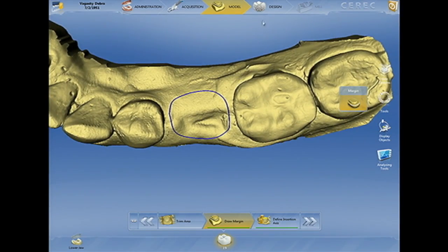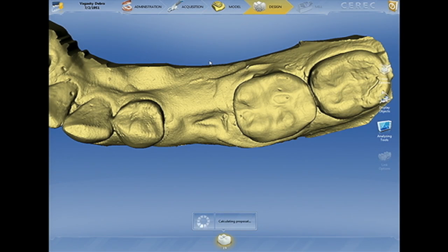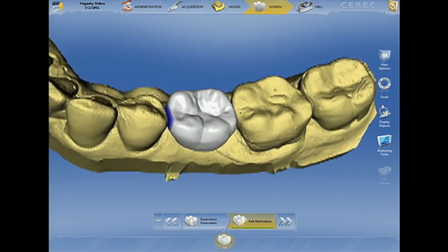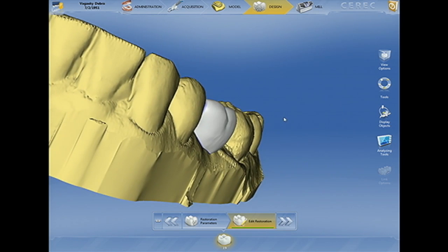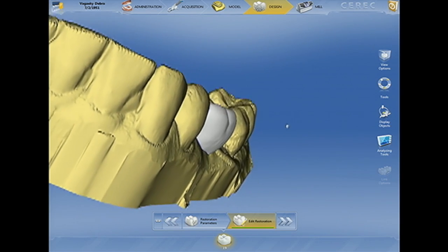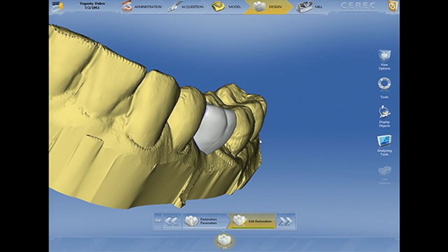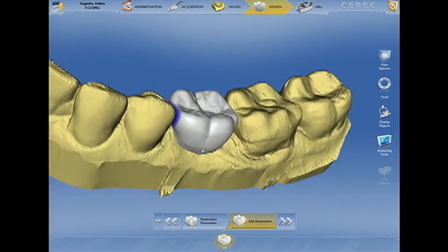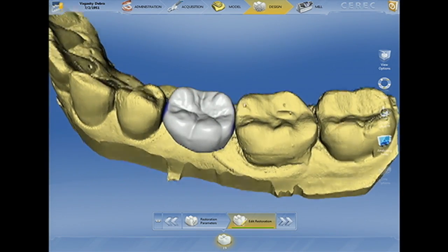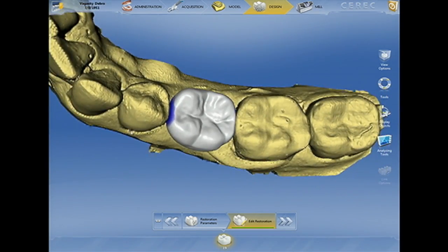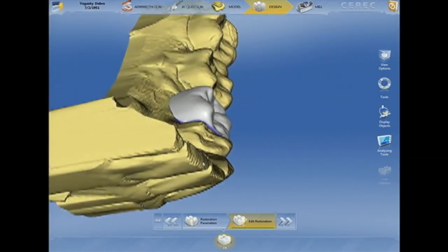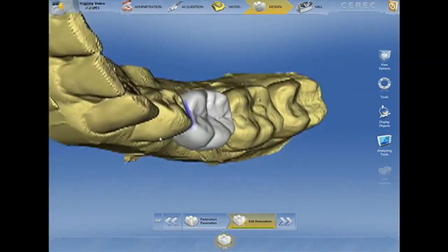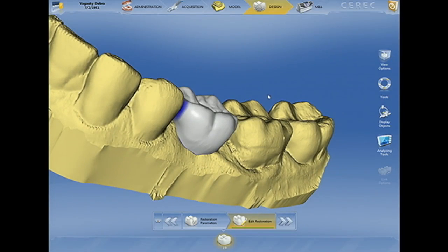Because I haven't necessarily taken the time to get the opposing, sometimes the software may not give us an exact proposal that's appropriate. But most of the time, it gives us a pretty darn good proposal, as you see here. What I'm looking for is having a tooth that really represents the restoration I envision for my patient — it's in the occlusal plane, it's got adequate proximal contacts, and the buccal and lingual contours are most important to me.